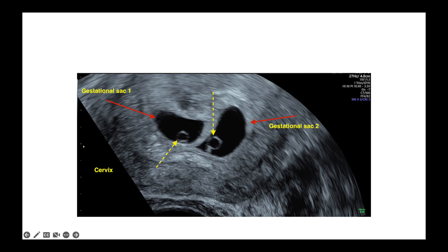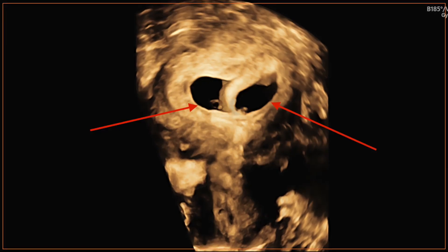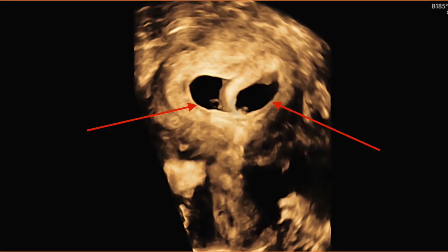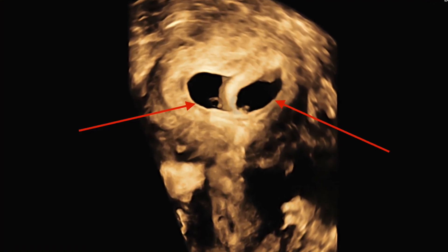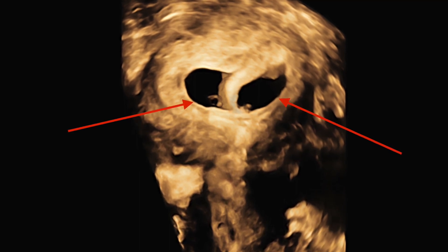This picture demonstrates a yolk sac seen within each individual sac, which is more suggestive of dichorionic pregnancy. Exact chorionicity is determined when the crown-rump length is between 45 and 84 millimetres. This is the 3D picture showing the uterus with two gestational sacs.